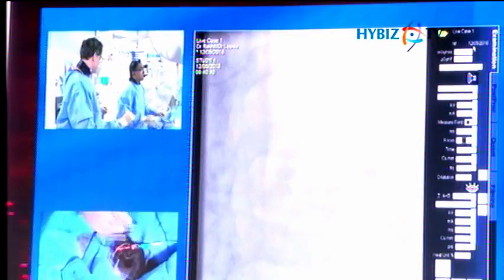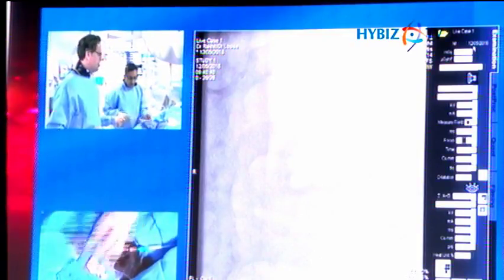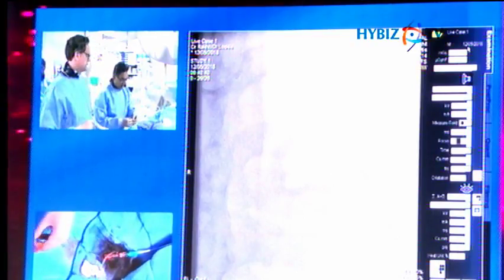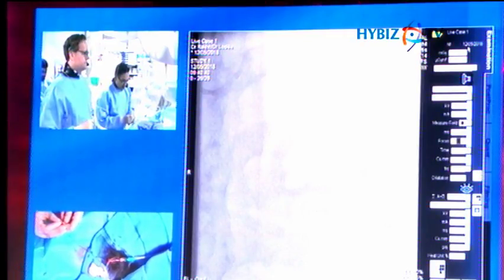And in terms of the characteristics, the ideal is it's a bit like with the... Sorry, go ahead. Well, I was just going to say it's a bit like the experience with the BVSs, that lesion preparation and one-to-one predilatation is mandated really. I was going to say in terms of the characteristics of the stent for radial strength, it's not like the peripheral stents where it'll have a fair amount of radial force exerted outwardly, right? It tends to be a little bit less outward exerting force, or am I mistaken at that?